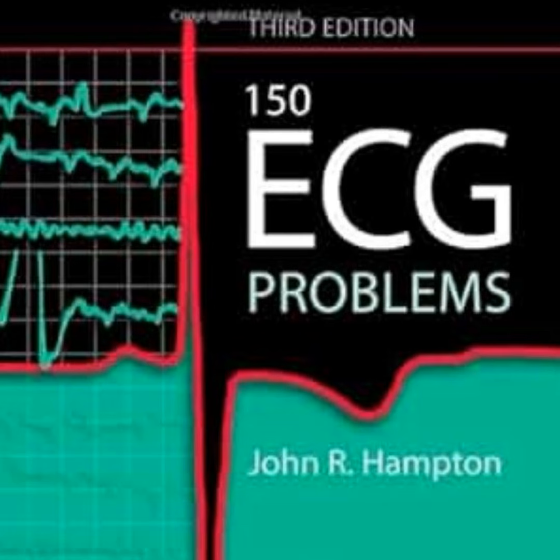Right. So if we take this concept that a normal ECG doesn't guarantee a healthy patient, and we flip it, we arrive at another one of Hampton's core lessons, right? Yes. That an abnormal-looking ECG does not automatically dictate the presence of an actual disease. Which perfectly explains the really unique structure of his book. Yeah, I love how he organized it. It's so good. He doesn't group the 150 cases by pathology, like putting all the bundle branch blocks neatly in Chapter 4 and then all the tachycardias in Chapter 5. Right, which is how every other textbook does it. Exactly. Instead, he presents them completely randomly.